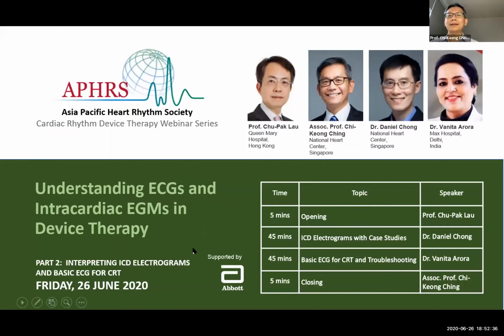Thank you, Jeremy. I hope everyone has learned a little bit about ICDs and CRTs. As I mentioned earlier, it's not just the implantation techniques that we must be familiar with, but also the post-implantation techniques to optimize the CRT, to troubleshoot an ICD, and to recognize how it behaves and how the device thinks on an ECG.